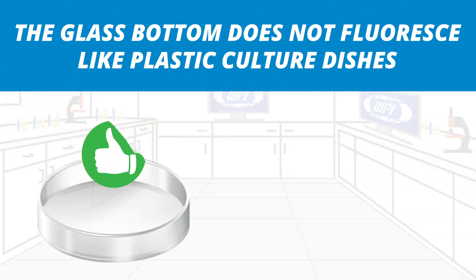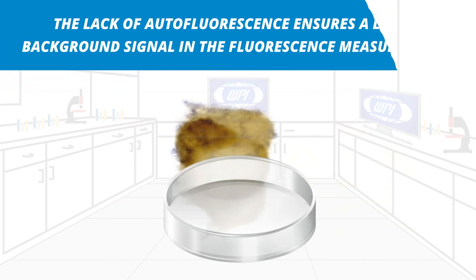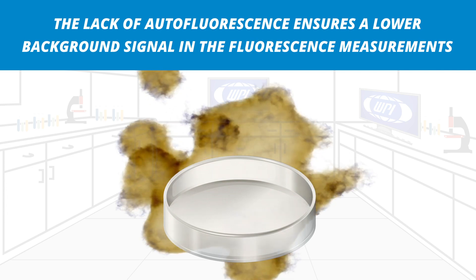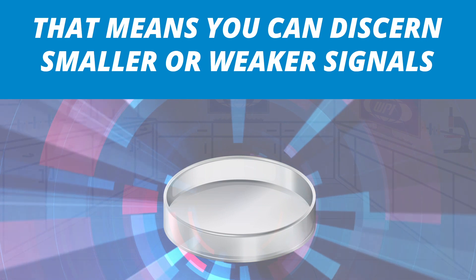The glass bottom does not fluoresce like plastic cultured dishes. That lack of autofluorescence ensures a lower background signal in the fluorescence measurements, meaning you can discern smaller or weaker signals.